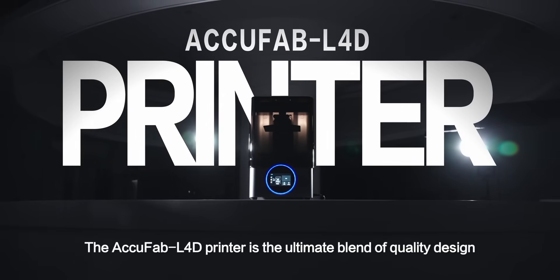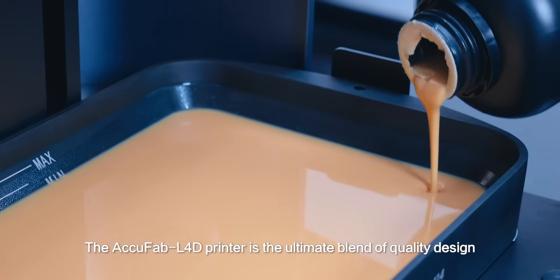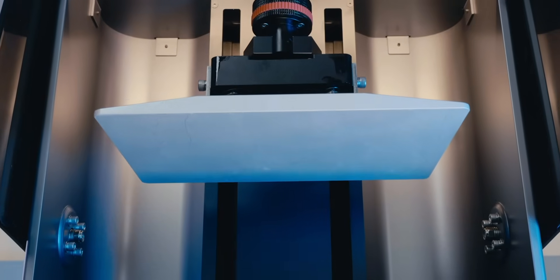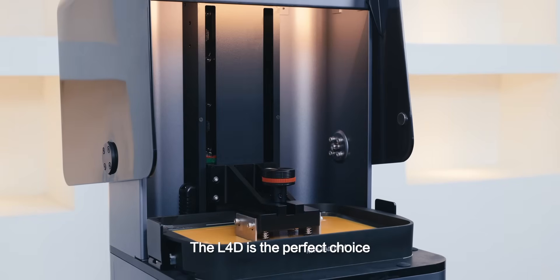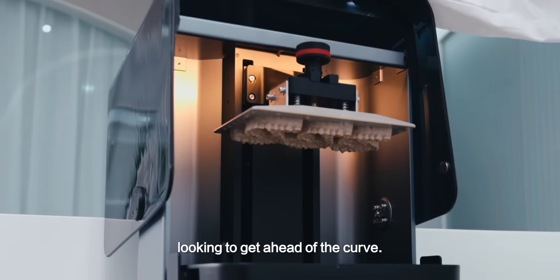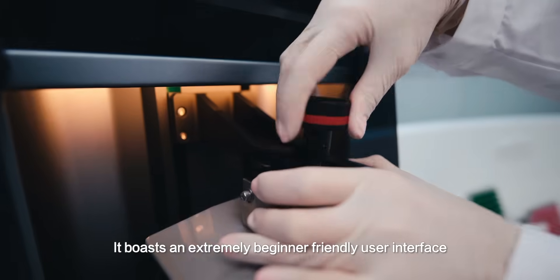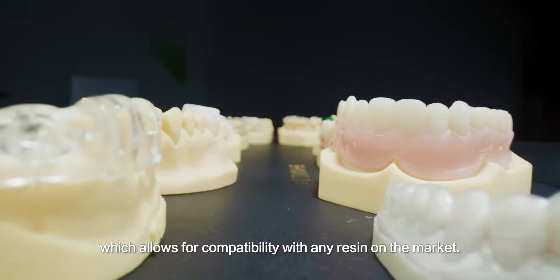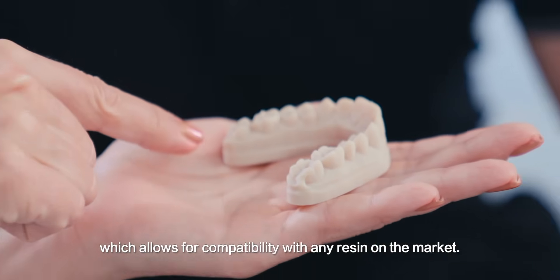The AccuFab L4D printer is the ultimate blend of quality design, accuracy, size, speed, and affordability. The L4D is the perfect choice for labs and dental offices looking to get ahead of the curve. It boasts an extremely beginner-friendly user interface in an open-source format, which allows for compatibility with any resin on the market.